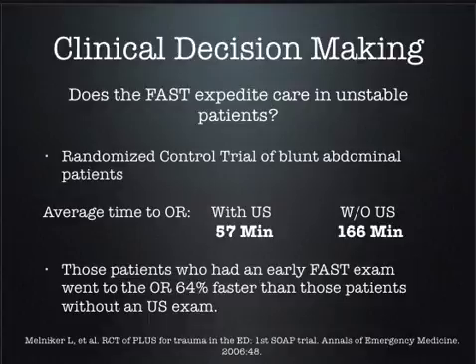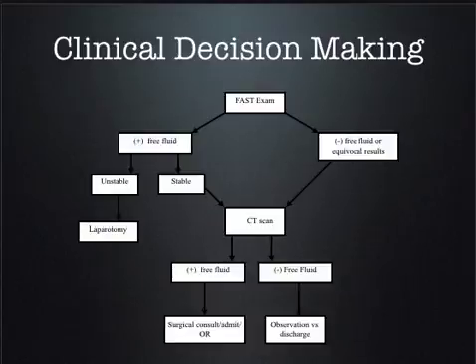That's why I tell you to do it on every patient. Do it on every patient because you'll be surprised. You're going to put the transducer on there at some point and you're going to say, I'm doing another negative FAST. This one's positive, and you're going to go faster. And you're going to change the mind of some surgeon that was going, yeah, I want to go see this other trauma patient. No, they're going to pay attention to that patient because they know they have an injury. So it helps you know who to treat quick and who maybe can be a little bit slower, right?